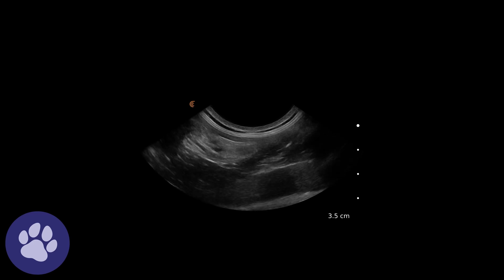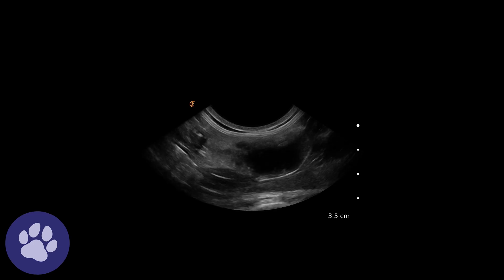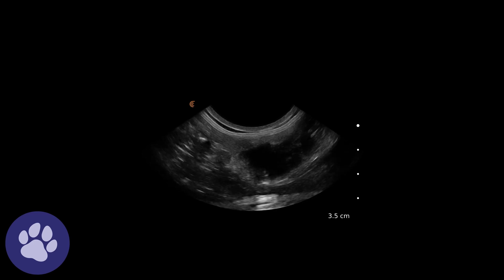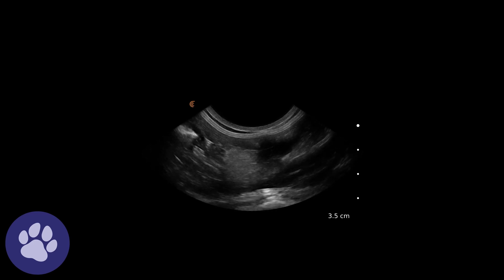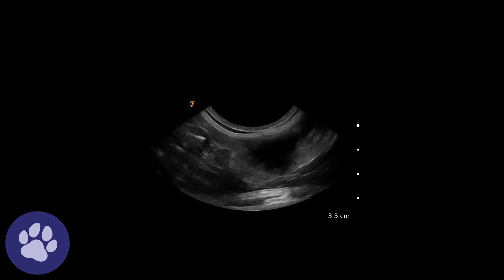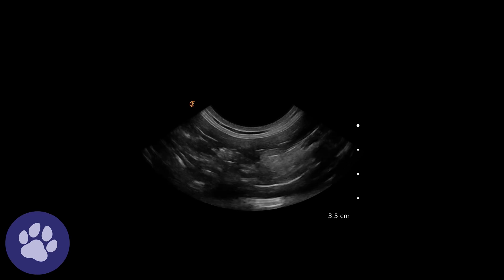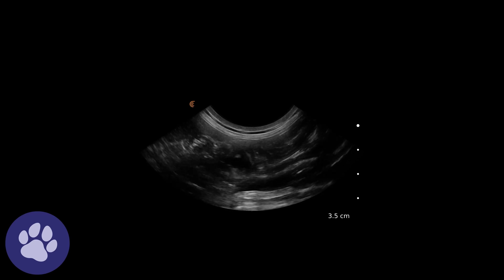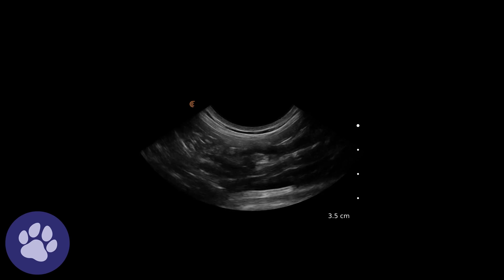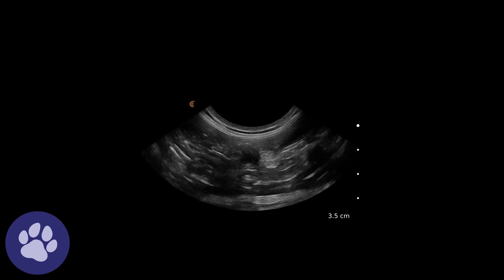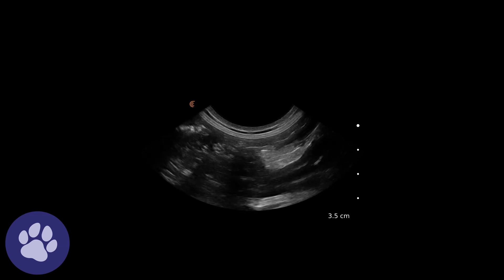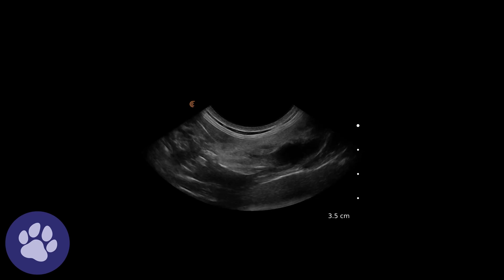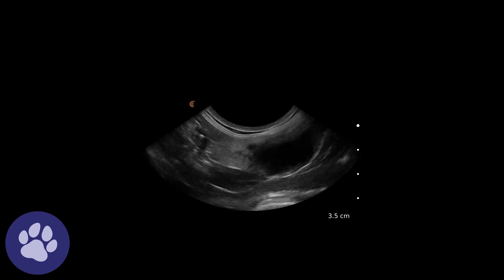Continuing to investigate, following in a couple of planes to see from a few different viewpoints how this mass is associated with the jejunum.